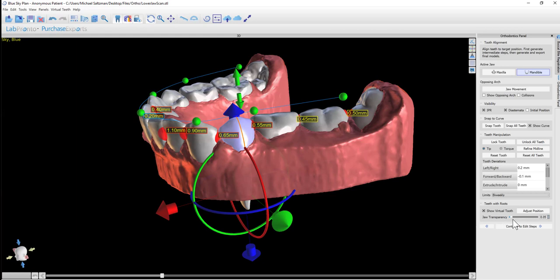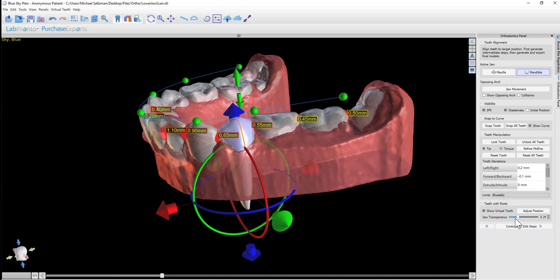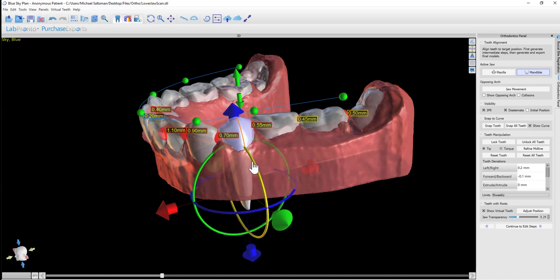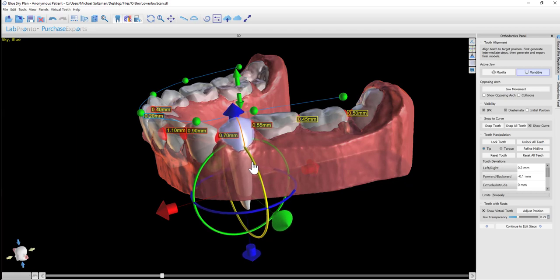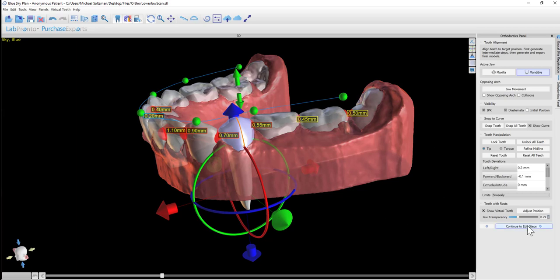We can use the jaw transparency slider to be able to see through the jaw and see the roots and how the roots move with the tooth when we rotate with the widget. Once we have our final tooth setup, we can click Continue to Edit Steps.